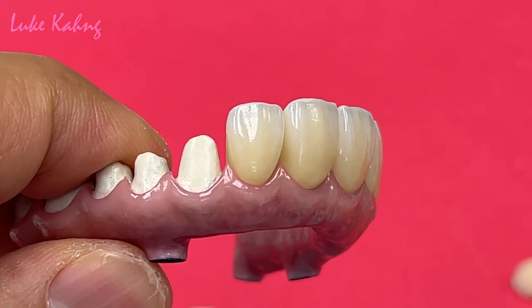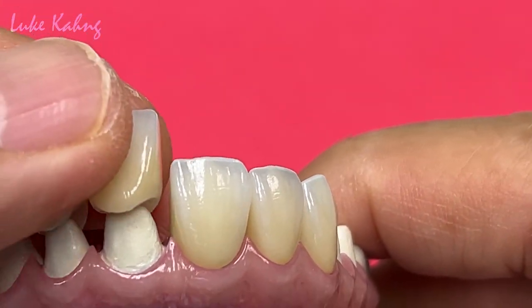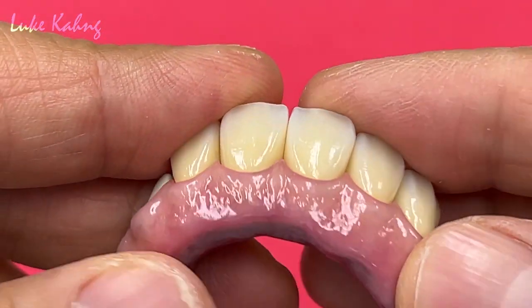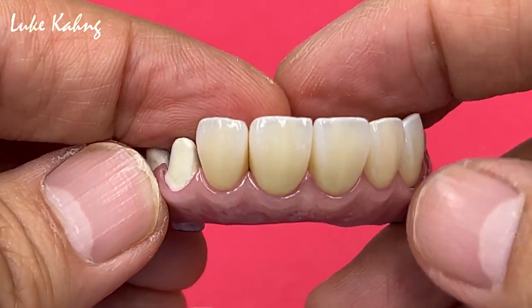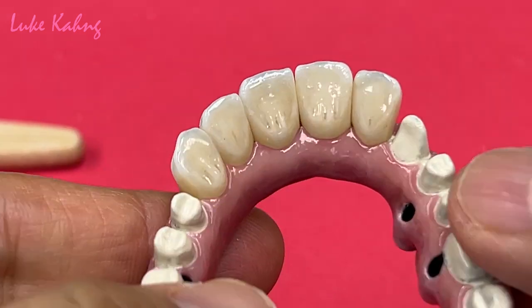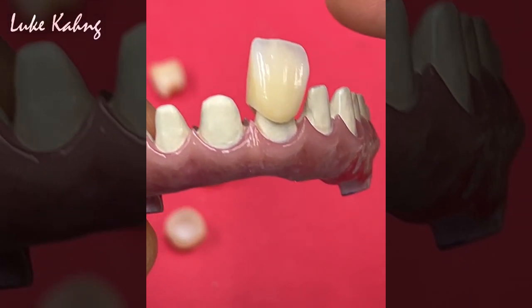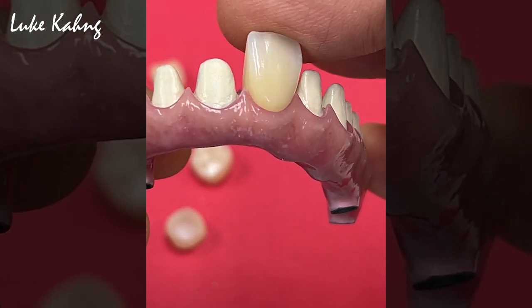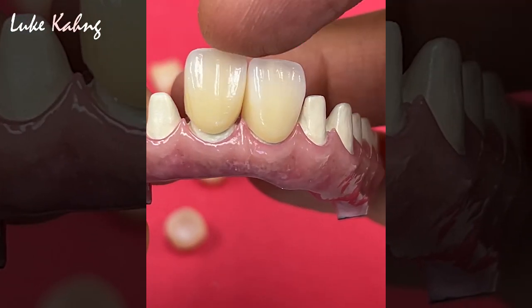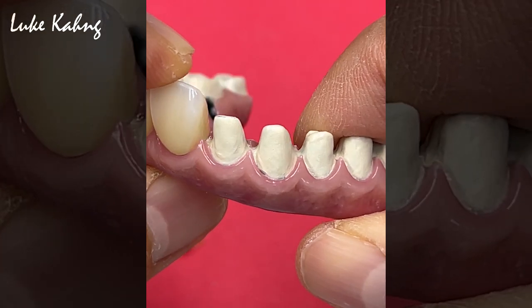This is another case coming soon — one by one fitting. Look at this underneath — exceptional case though, it's very good. To try in the single, see the adaptations between the tooth and the proximal embrasure, like here.